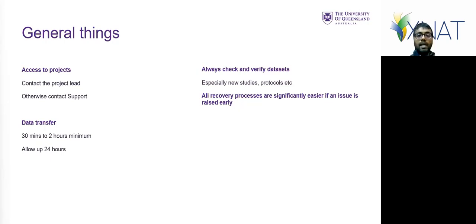Yep. I'll just repeat that. So from the HERP point of view, they'll store the data on the scanner for about 2 weeks because the scanner will run out of space and there'll be a lot of issues then. So if you can't alert that a data set has been affected within 2 weeks, it will be very difficult to do any kind of recovery operation.